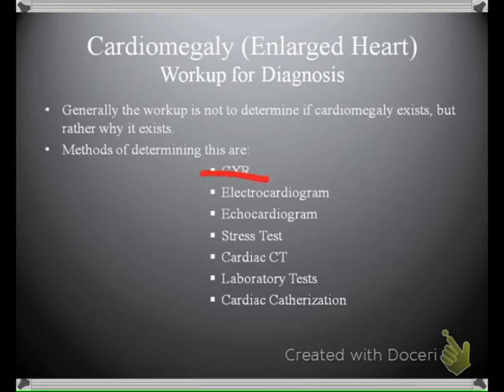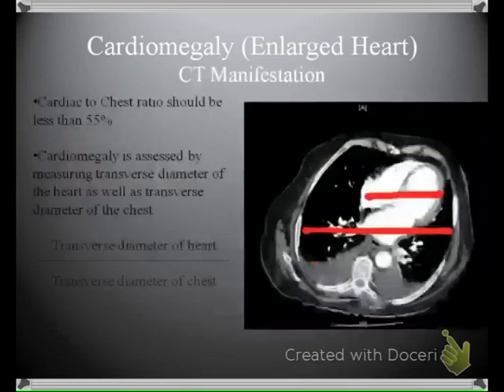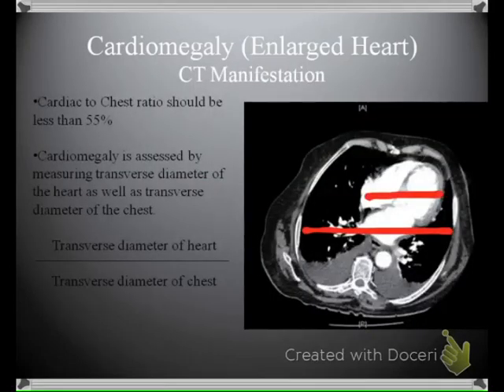However, if chest x-ray will not suffice, many times we see that those chest x-rays are labeled as abnormal, and that pretty much opens the pathway to do a cardiac CT or just a plain chest CT without contrast. As we are concerned with pathology relating to CT, let's assume that this patient has an abnormal chest x-ray or an enlarged heart on a portable chest x-ray.